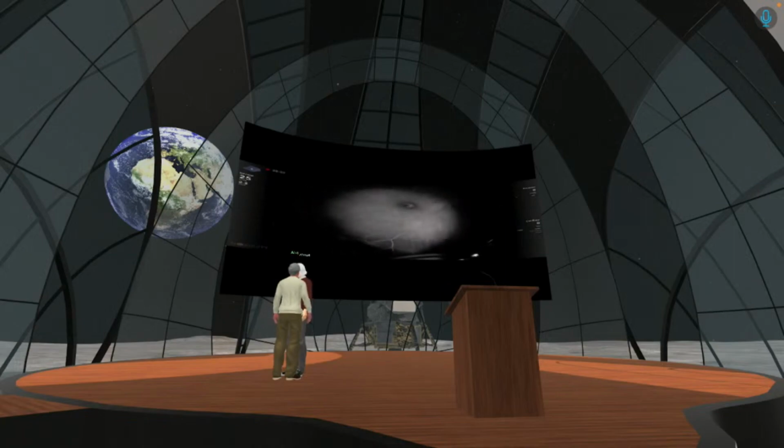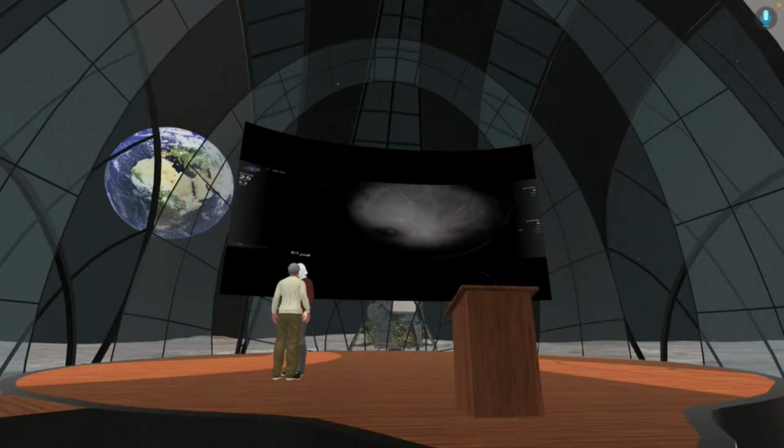Okay. Here is the periphery with indentation. We might see the periphery. Here we have a retinal detachment, limited detachment around the optic nerve, and the differential diagnosis here might be an exudative one, but there is no leakage inside or collection of something as exudate.